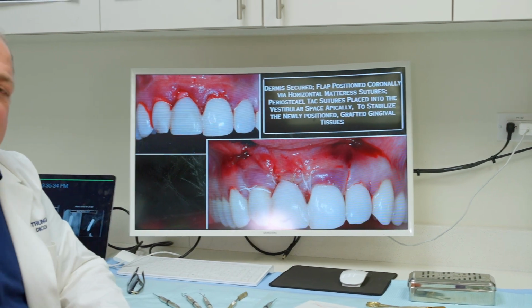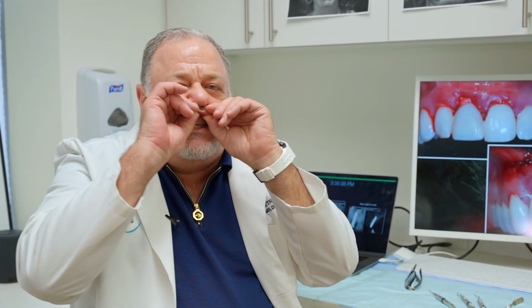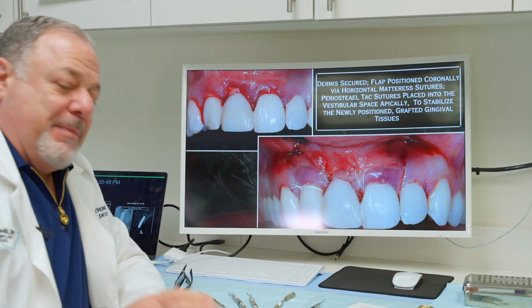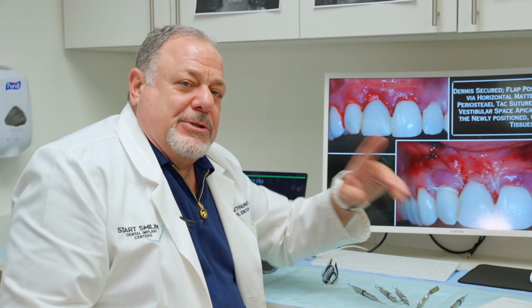Those are periosteal tacks. And the reason we put those in is because when the patient goes home and goes like this with her lip, everything above the lip will move, but everything below the lip will not. So I'm going to make it so that she can't move this graft by putting these 2 sutures in here. And I generally tell patients, listen, for 7 days, you're going to really hate me. Not because of what we did here, because of those 2 sutures.